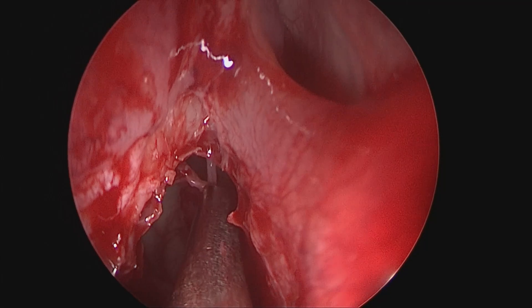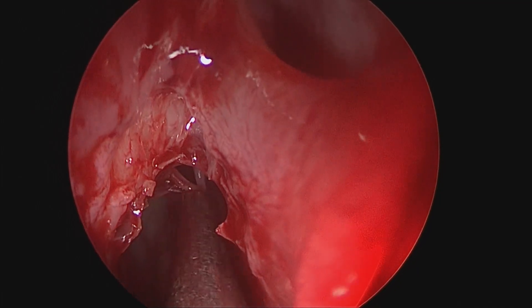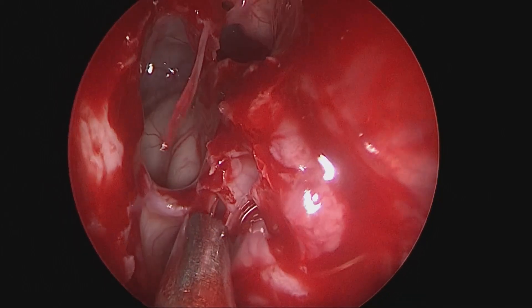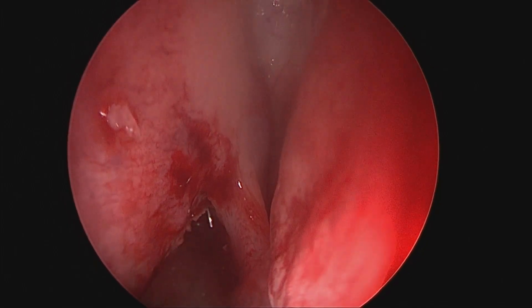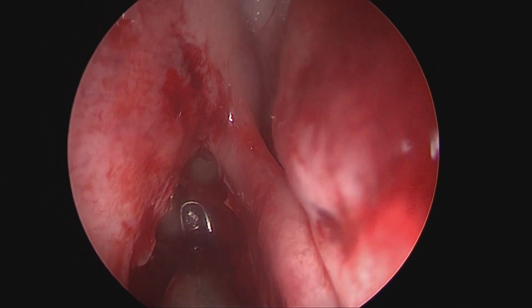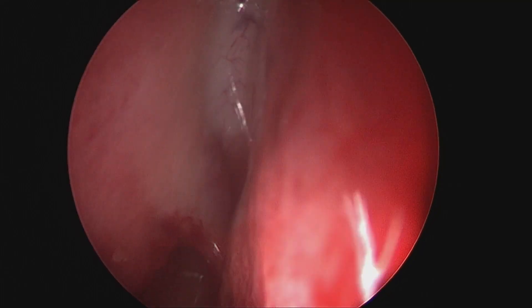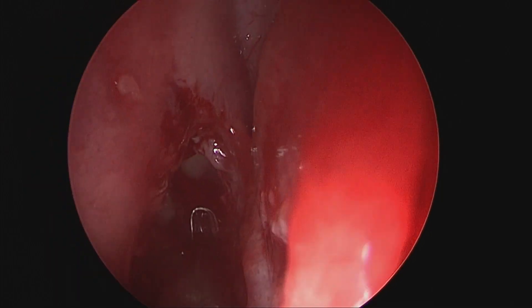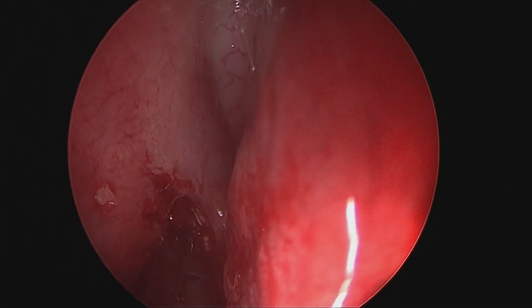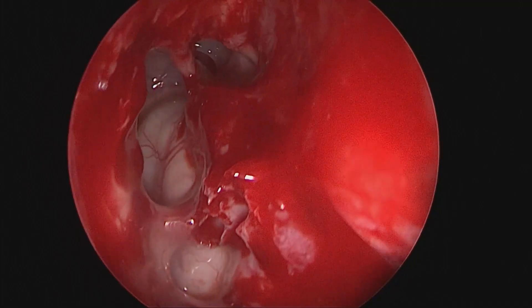One must avoid going too far posteriorly toward the posterior wall of this cell, because that is attached to the skull base at the level of the posterior wall of the frontal sinus. Any attempt to remove the party wall between the frontal sinus proper and the interfrontal sinus cell should be done only anteriorly at the level of the anterior wall of the frontal sinus, which is the safe region. We use the angulated articulated bone punch to remove more of the frontal beak — a thick bone — so our axis and vision inside the frontal sinus become clearer, and because this area will narrow down in the post-operative period; the more bone removed from the frontal beak, the better our overall post-operative control.